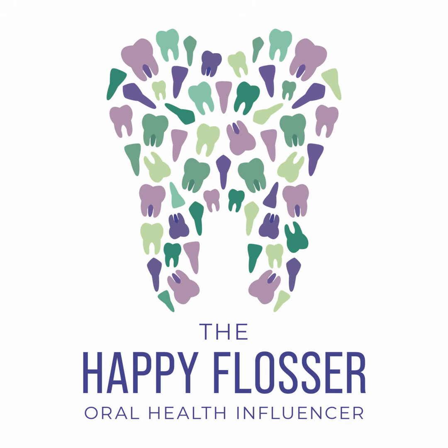And this is specifically due to the density of the object that you are trying to obtain an image of. All right, so I want you to think about a balloon. If you fill a balloon with air, the molecules inside that balloon are further apart. So radiation can penetrate that balloon pretty easily, right? Air is the most radiolucent image that we take.